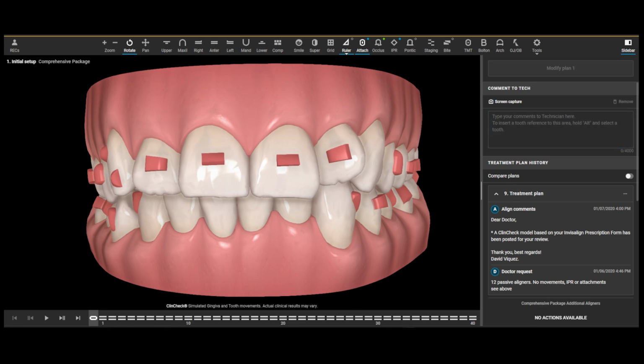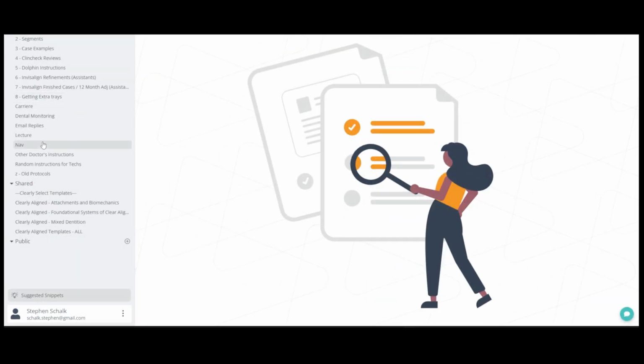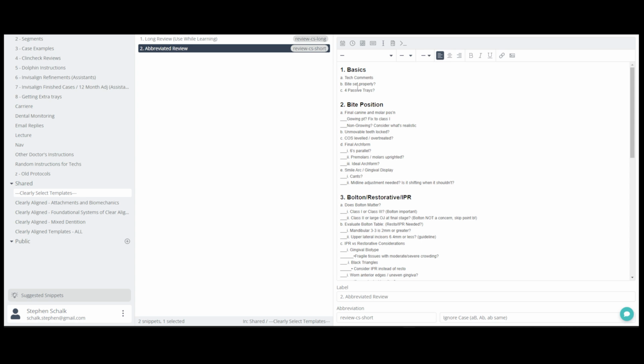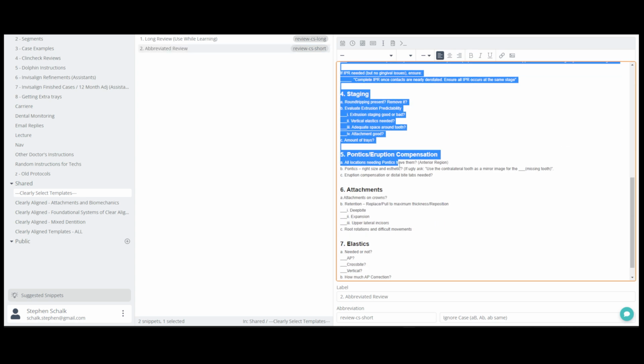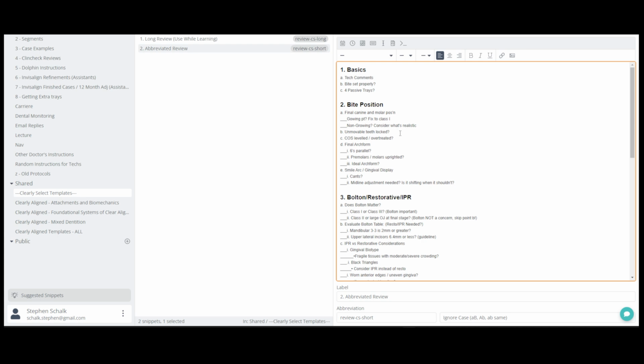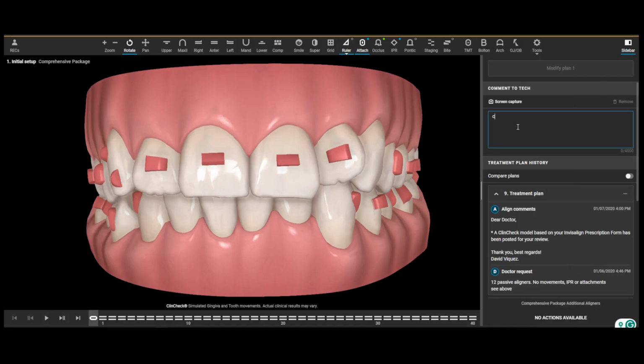The program that I use is called Text Expander. Anybody who's in our Clearly Select group has access to the full range of templates. Inside these templates, there are the Clearly Select templates. I have both a basic one and a long one to really walk you through each individual thing. You can see that we have a list of instructions that we're going to go through to see if we need to modify or adjust anything. So I can go ahead and type in now.